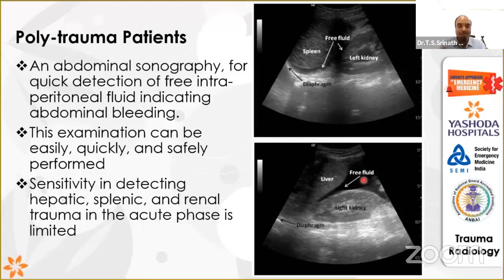And then also see how it is helpful. Once you stabilize the patient, take a CT scan, you see how you can diagnose a C-spine fracture or thoracic fractures or lumbar fractures, whatever fractures there are, and also diagnose multiple other fractures. So these are the things we do in our emergency department, that is a multi-detector row CT or MDCT, which is more accurate to detect the fractures.